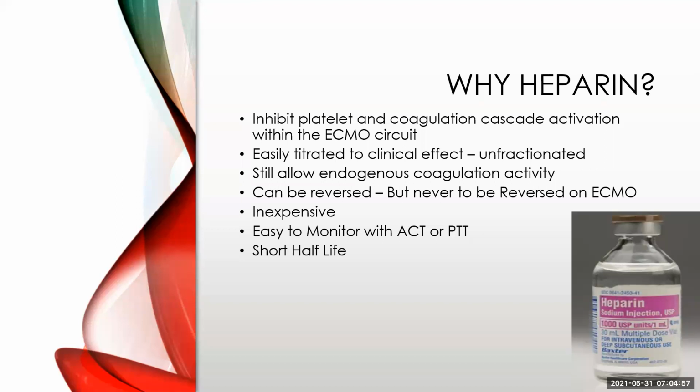It is reversible, although we never reverse heparin on ECMO, because you're going to clot your membrane and then you won't have an effective ECMO run in the end. It's easy to monitor with your ACT or your PTT. It's got a short half-life, which means it drops on its own if you don't give it anymore. So we use heparin as the most basic one to anticoagulate the patients on ECMO.